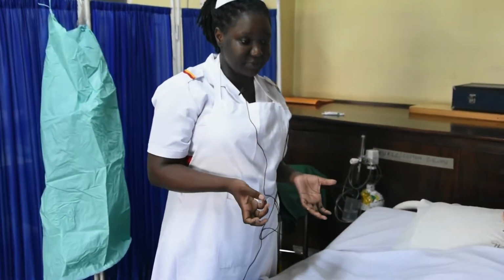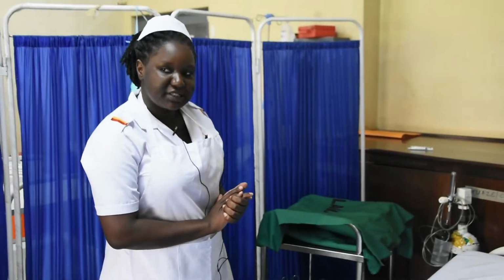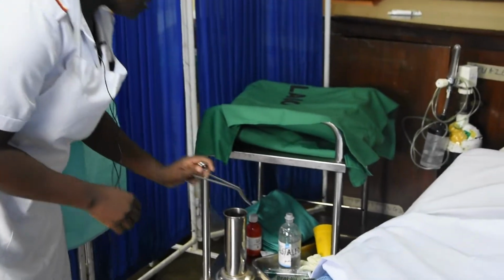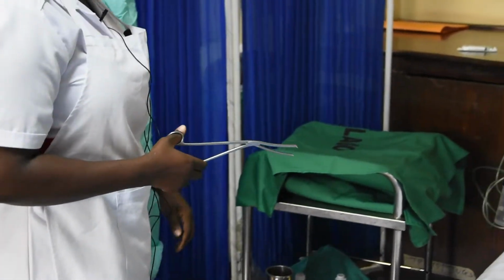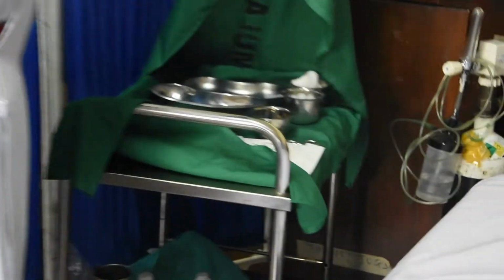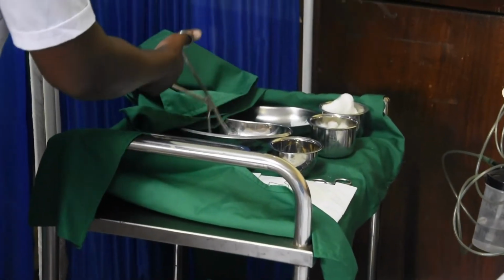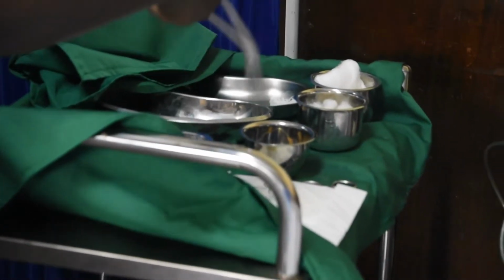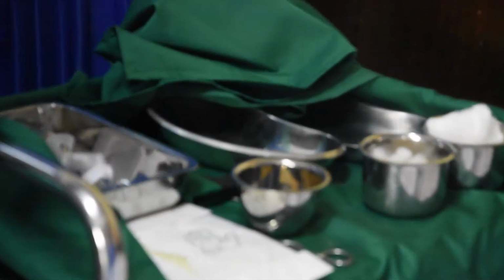However, before we start on the procedure, we have to present our trolley. Tracheostomy care is a sterile procedure, so we need a sterile trolley. And on the top shelf, we shall need 3 different gallipots, one for cotton swab, the other one for the gauze swab, and then the other one for the antiseptic solution.